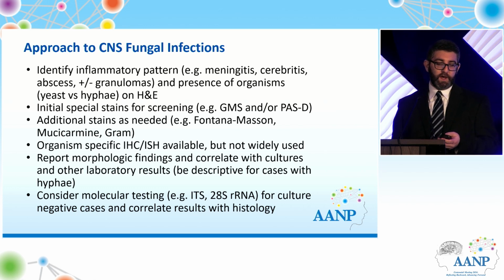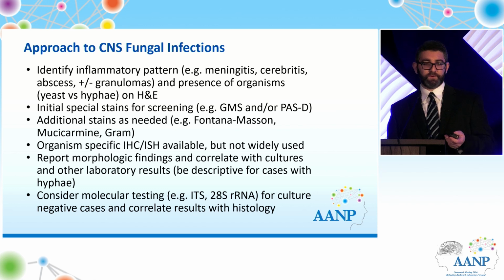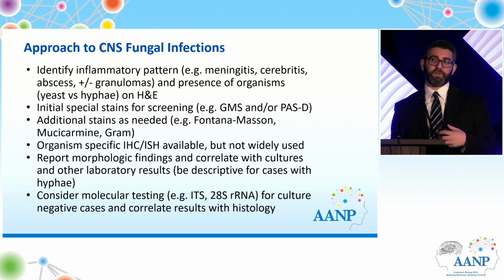There's some confirmatory stains that can be helpful in certain situations, like Fontana-Masson and mucicarmine for cryptococcus and gram stains for Candida. There are IHC and ISH stains available, but they're non-specific enough just because of the common components of the cell walls that they're not super reliable, but they are used. And again, report all your histologic data, integrate with the molecular, and we'll talk about that in a second.